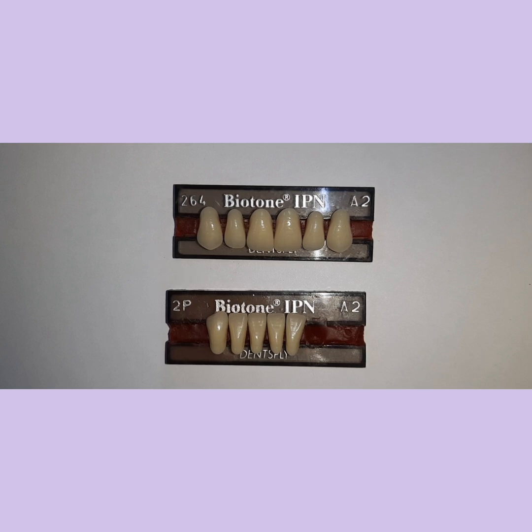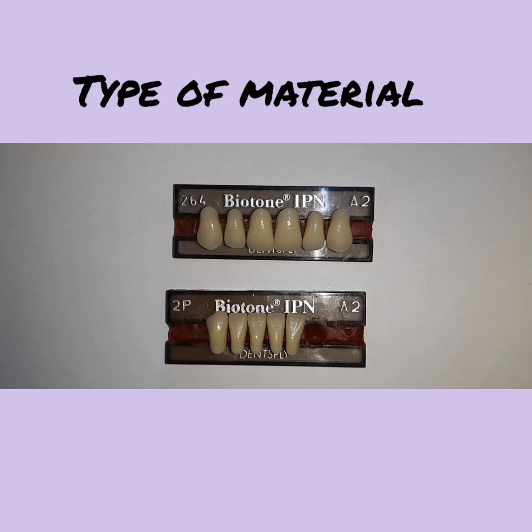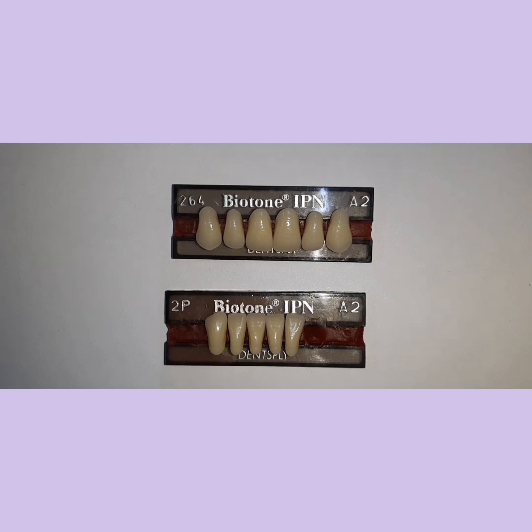Next, the type of material used in anterior teeth. Two types of material are used in anterior teeth. Usually it is acrylic teeth, and you can also use porcelain teeth. Each has its own advantages and disadvantages. Although you have a higher strength version of acrylic teeth which are cross-linked, having greater strength and adequate wear resistance, which are available today, each material has its own advantages and disadvantages.